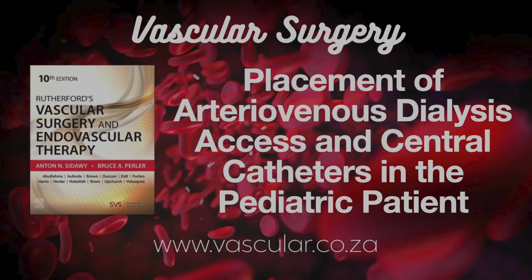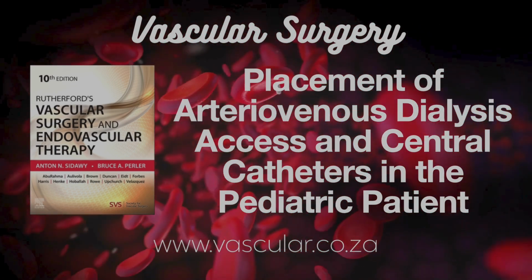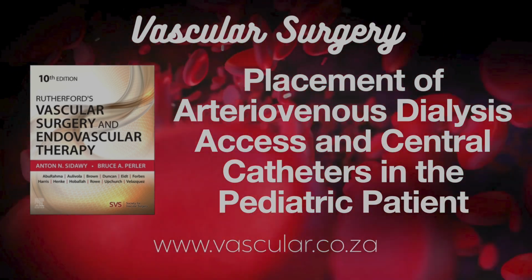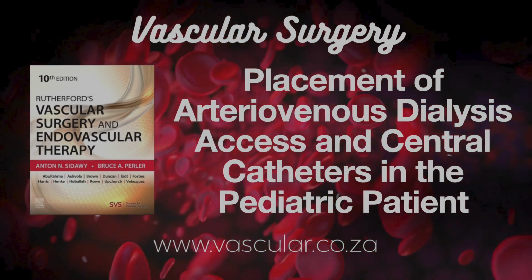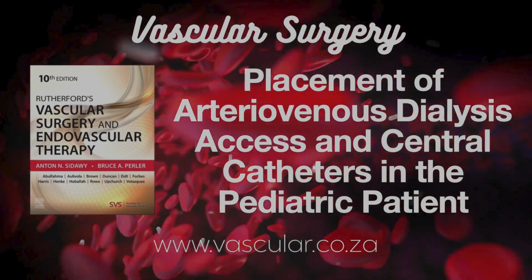Let's hone in on CVCs again. Prevalence at initiation is high, 78 to 83% since 2006. Hasn't changed much. Why stick with them? Well, we touched on it, the technical difficulty of AVF in tiny kids, yeah. Anticipating a short time on dialysis before transplant, so that's not always predictable. And definitely avoiding the needling aspect.